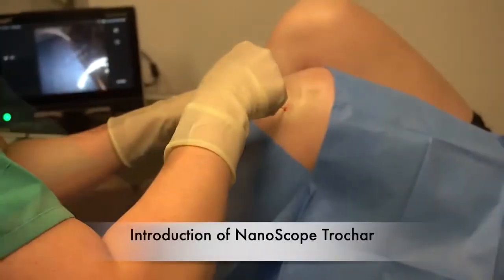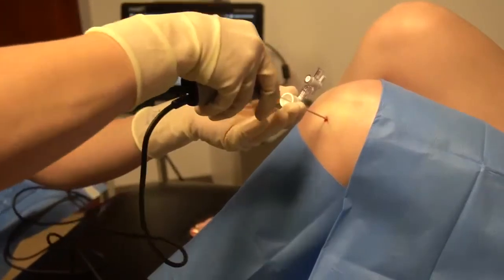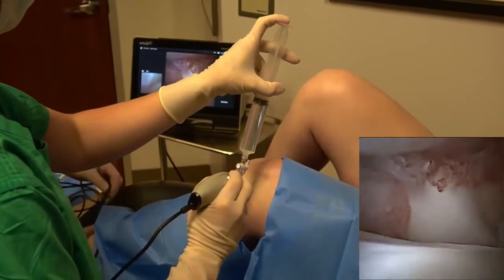Introduce the 2.2 mm inflow nanoscope sheath with the sharp trocar. Once inserted, attach the one-way stop valve and a 30 cc syringe of sterile 0.9% normal saline. Withdraw the trocar and introduce the 1.9 mm nanoscope needle arthroscopy system, which is about one-third the size of a standard arthroscopy camera.